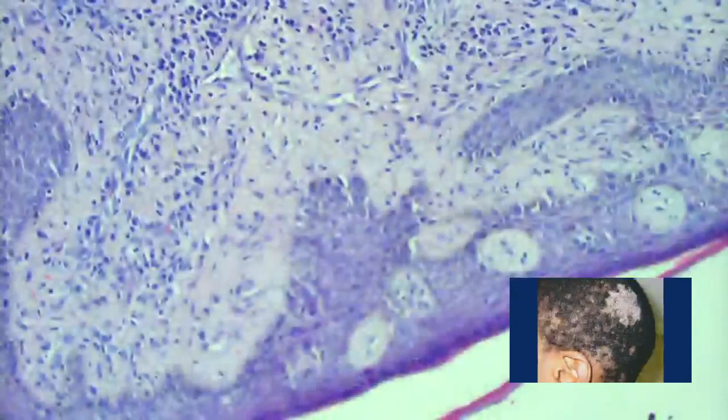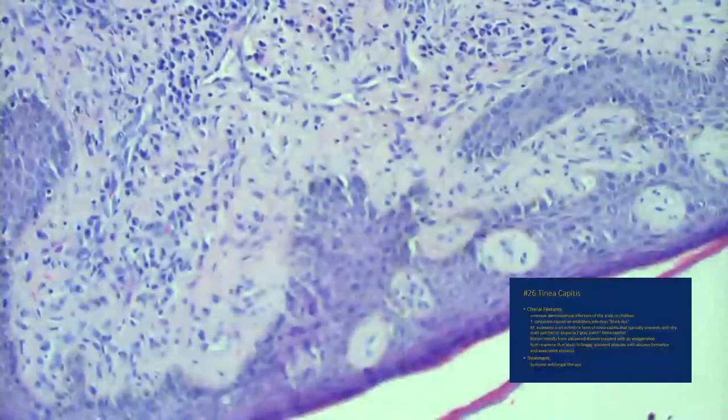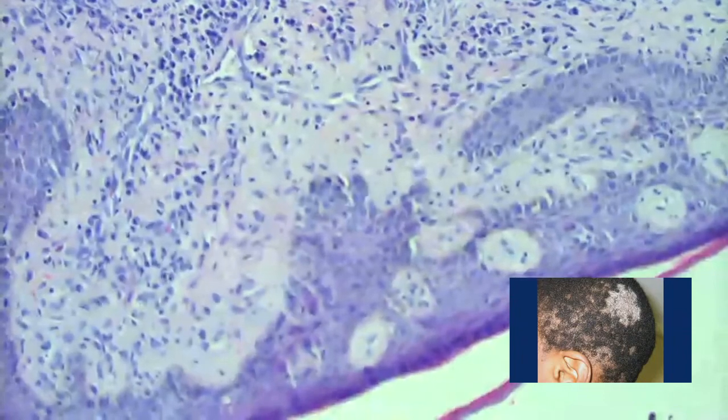What does it look like clinically? It can just be crustiness, or it can form a kerion, which is kind of a big boggy mass. It can cause kerion. Then you get a superficial, dense diffuse infiltrate in that. And then actually you get the so-called black dot. You don't see that here, but it's these little broken off hair shafts right at the follicular ostium, in fact, the teensy tiny black dots.